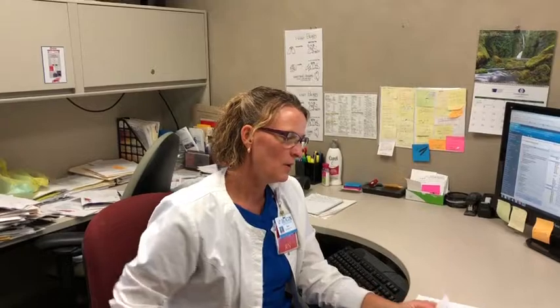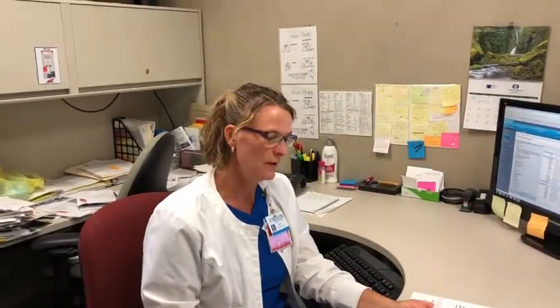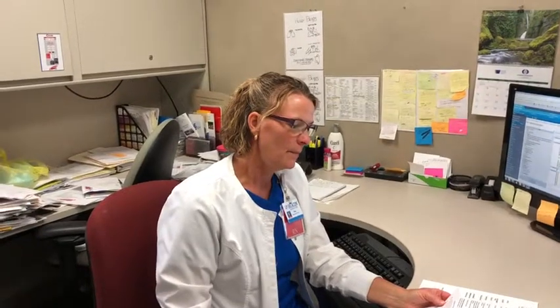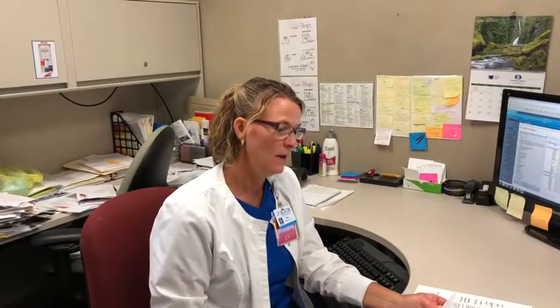So the SBAR, the situation is currently EGH policy states that we remove all insulin pumps. However, we are having some patients refuse to remove them. And so we're in the process of finalizing a Beacon-wide insulin pump policy, but we need an interim process. So background, the pump does have to be identified that the patient presents to ER with it, and that the patient must be assessed for competency to manage the pump for their emergency room stay.